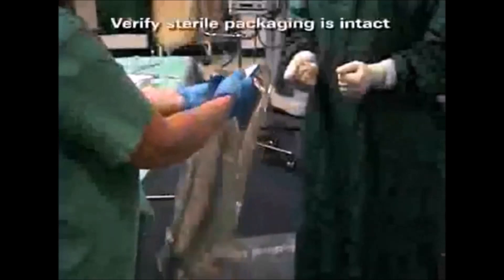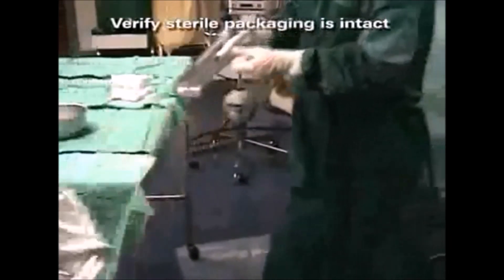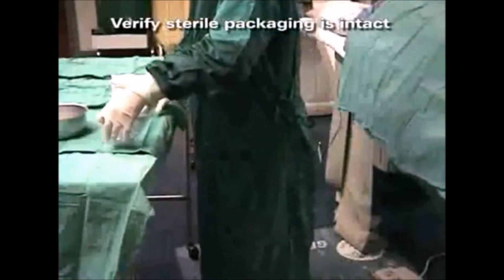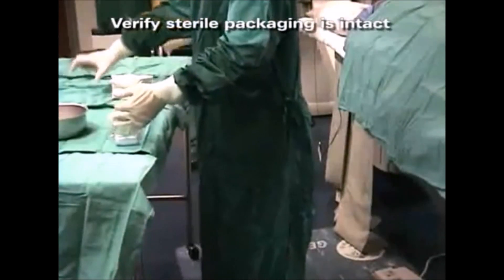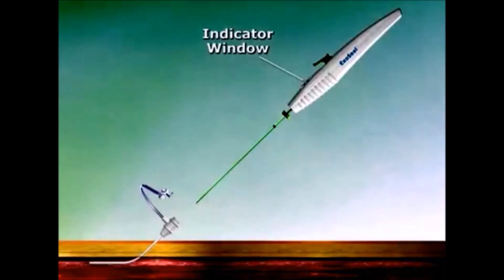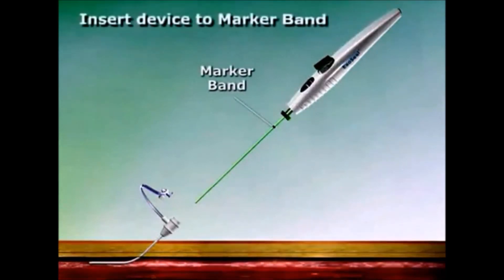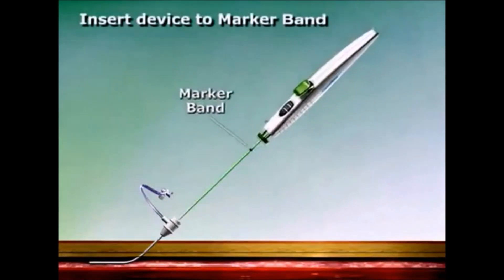To use the exo-seal device, verify that the sterile package is not opened or damaged prior to use and remove it from the sterile packaging using aseptic technique. Orient the device so that the indicator window on the handle faces upwards.